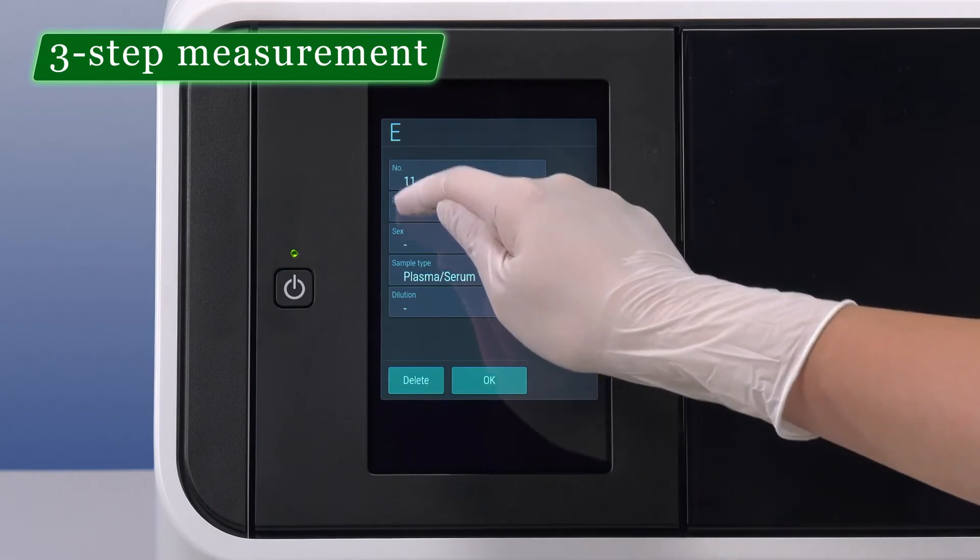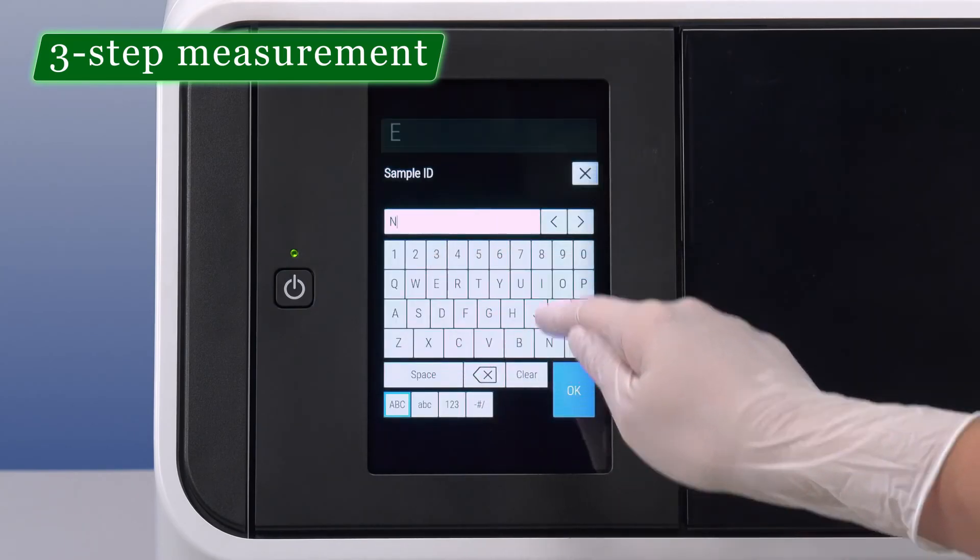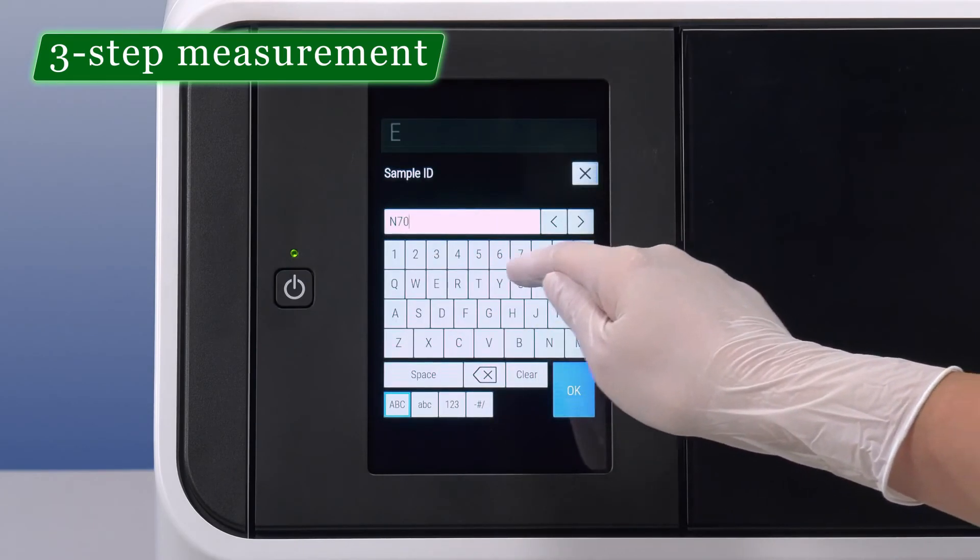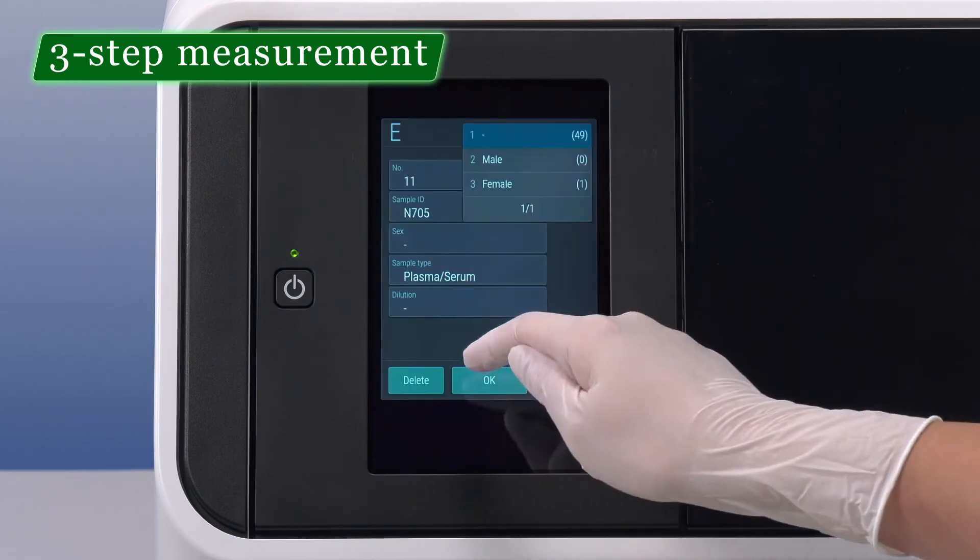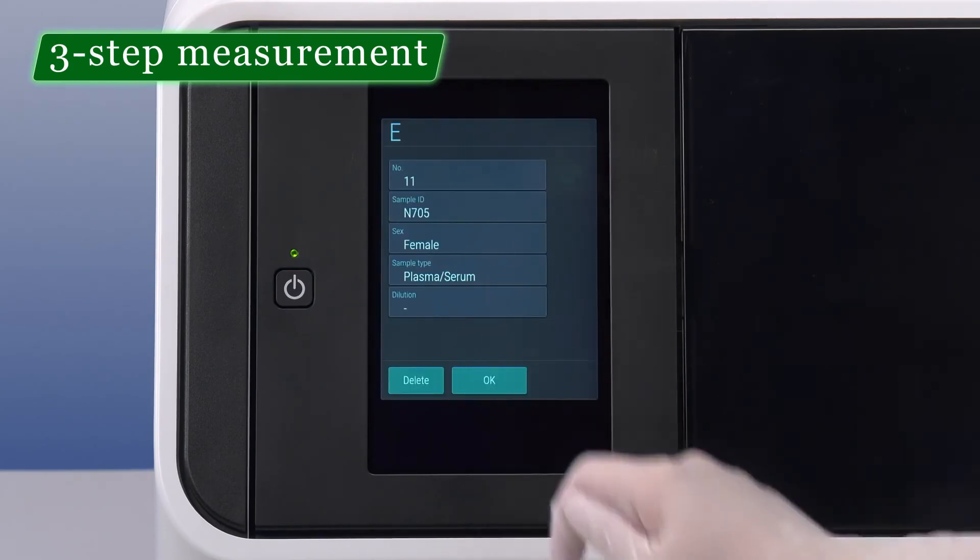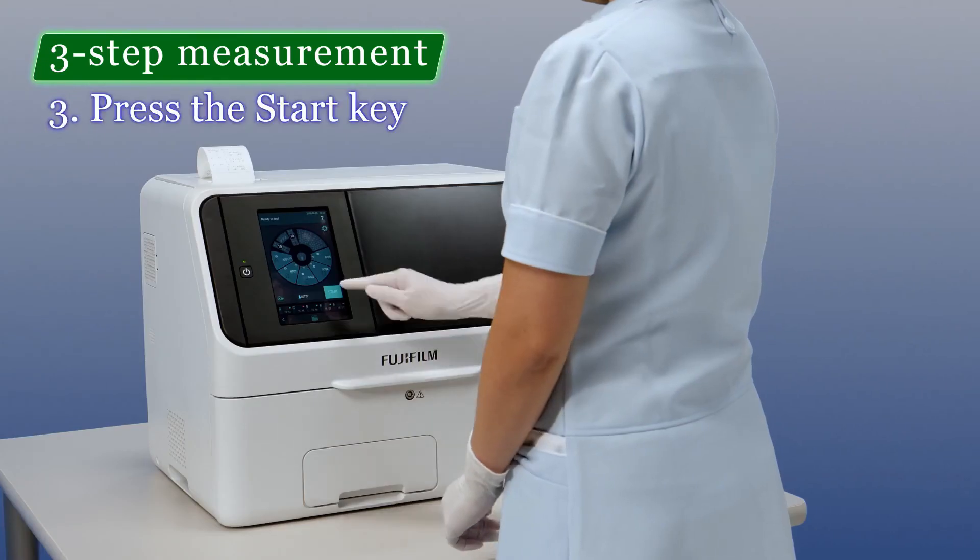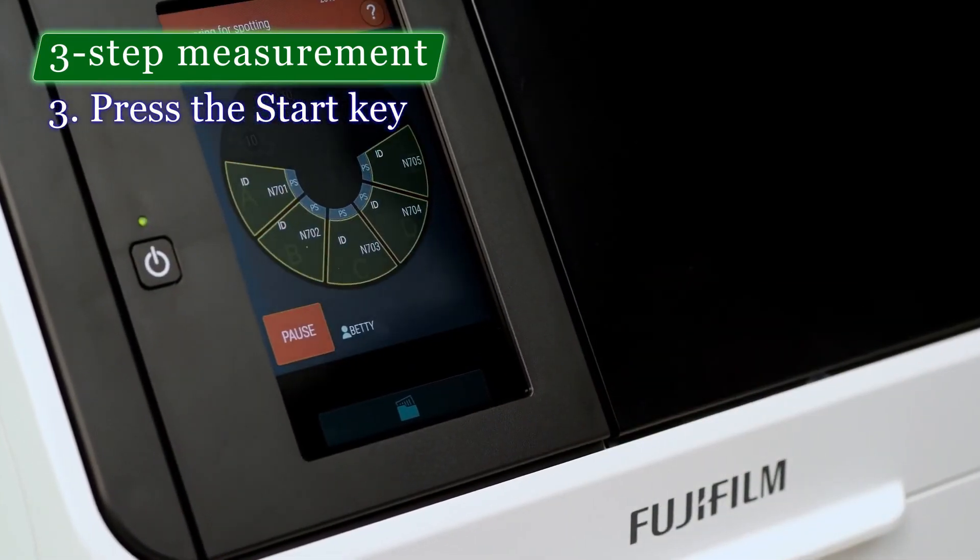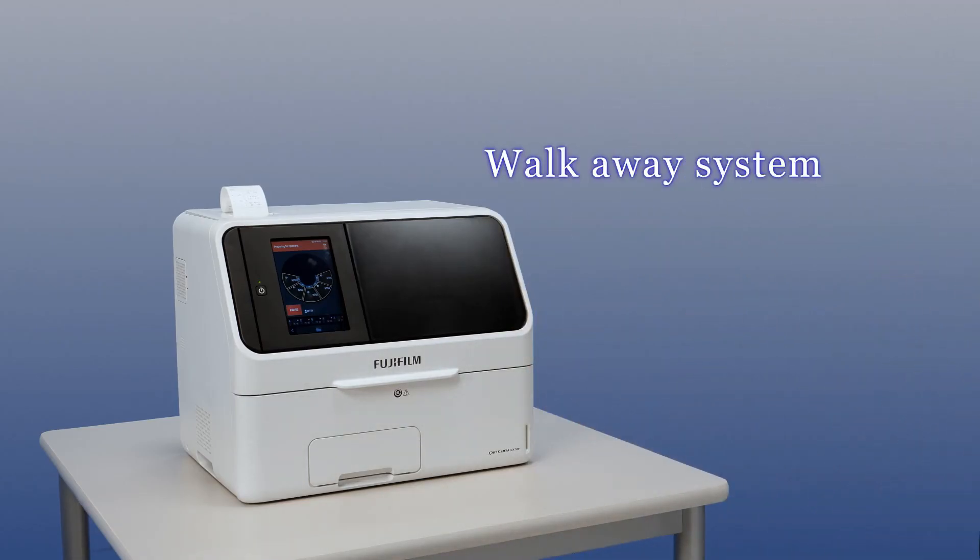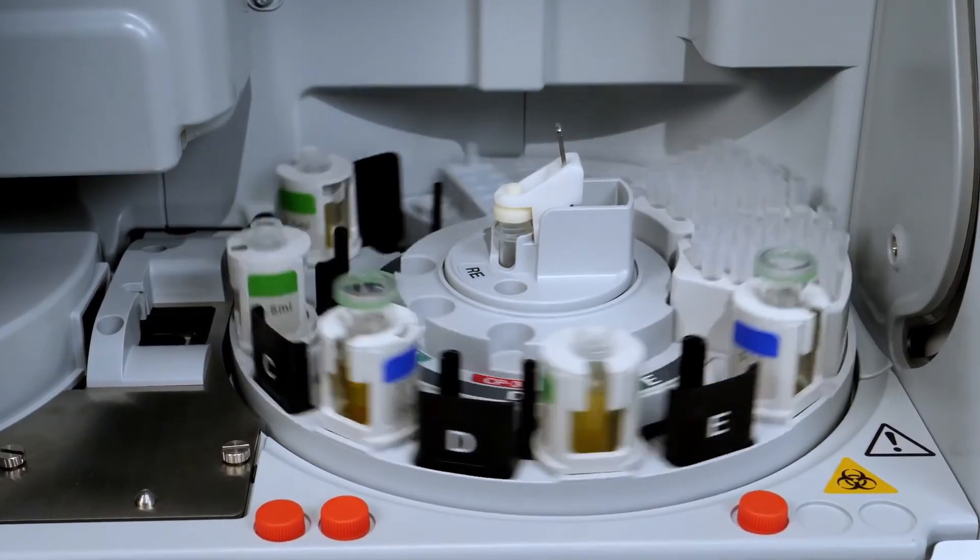However, results differ for certain parameters among dry and conventional chemistry analyzers. Dry chemistry analyzers are compact and easy to operate as these do not require storage space for reagents. There is no need for pipetting of reagents and these are semi to fully automatic and require small volumes of samples.